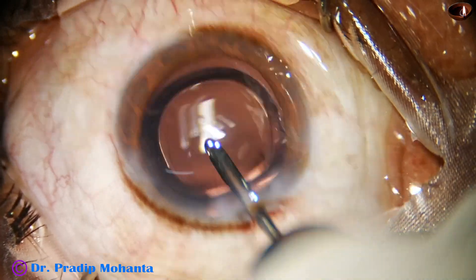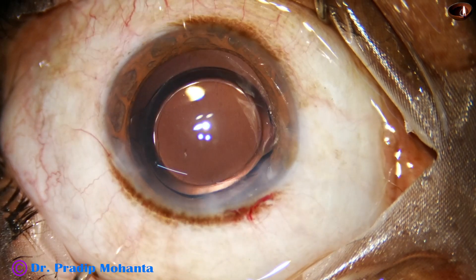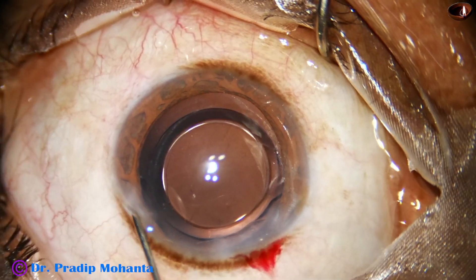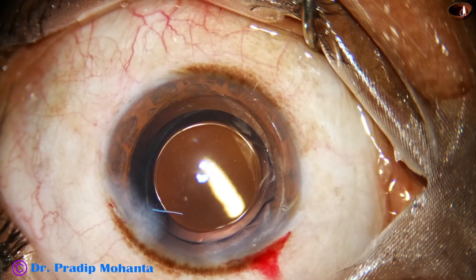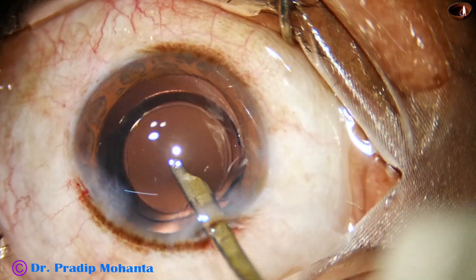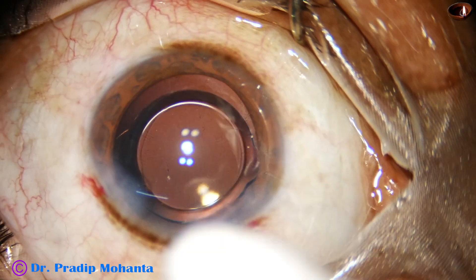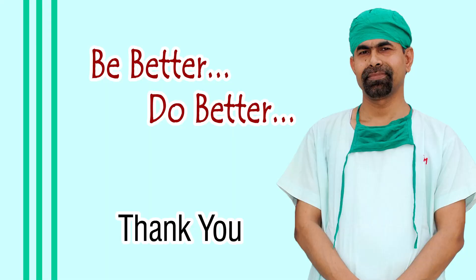No viscoelastic is in the anterior chamber or in the bag because of hydroimplantation, and after implanting the lens we have irrigated the anterior chamber as well as the space between the posterior capsule and the lens. The side port is nicely closed by corneal stromal hydration, and then the anterior chamber is nicely formed. Integrity of the wounds is checked, a few drops of moxifloxacin are applied over the cornea, and the case is concluded. Thank you very much for your attention.